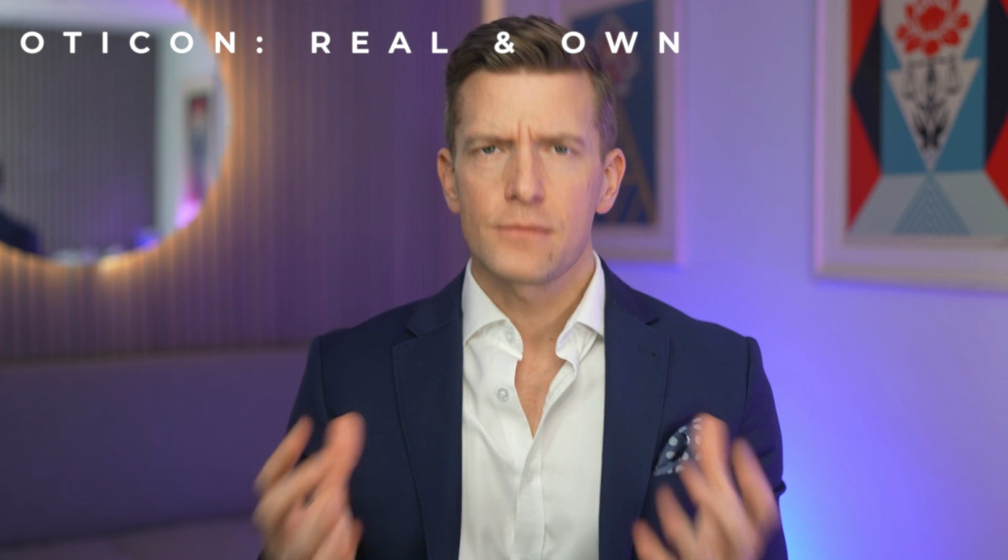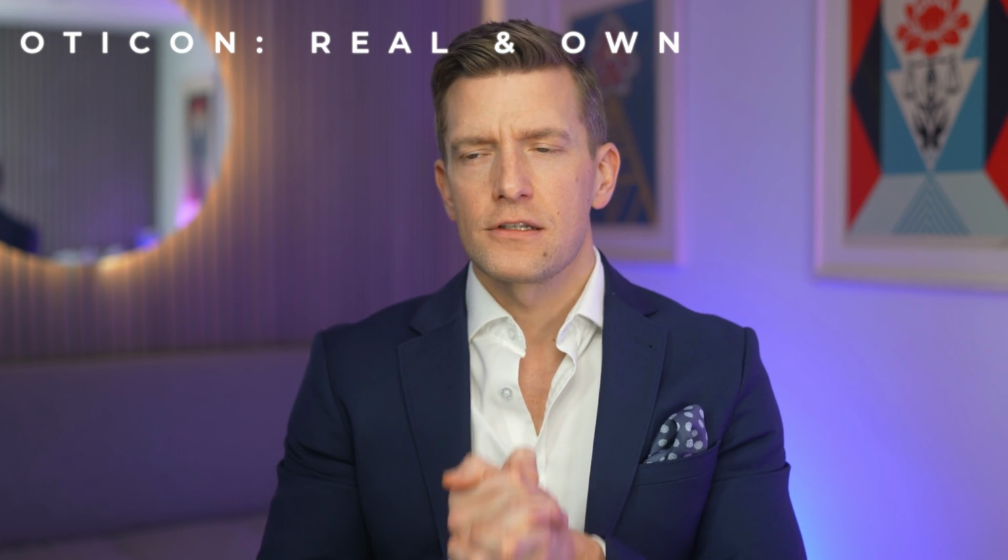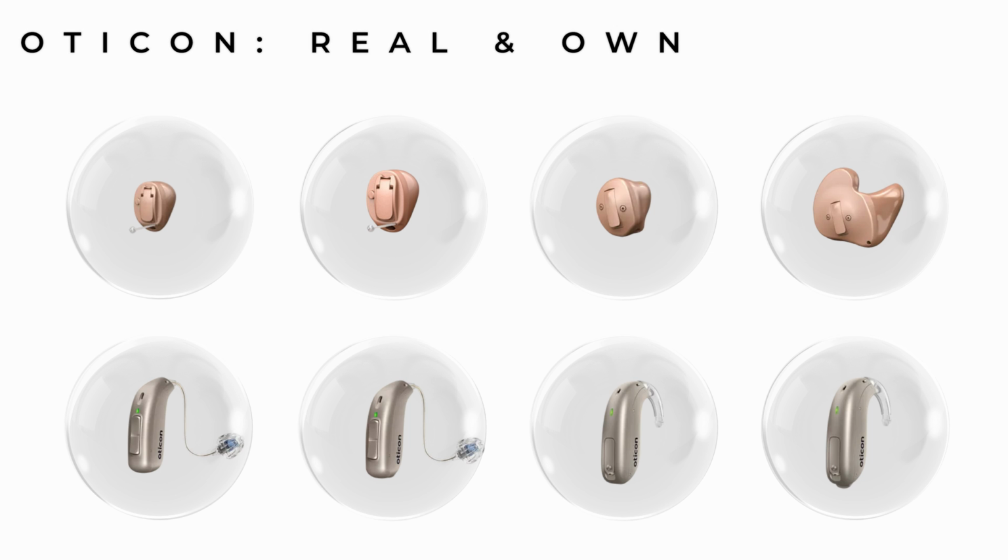and your hearing loss. Thinking about it now, it hasn't been all that long since we saw the release of Oticon's last round of technology. From their custom hearing aids, the Oticon Owns, which were released in September 2022 and included the IIC, CIC, ITC, and ITE models, to their receiver and canal style of hearing aids, which were released less than a year ago in March 2023, and included their receiver and canal Mini Rite R and Mini Rite T, their behind-the-ear Mini BTE-R and Mini BTE-T, and their CROS system, designed for any of you out there with single-sided deafness.